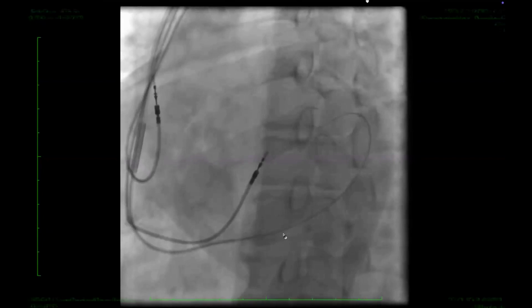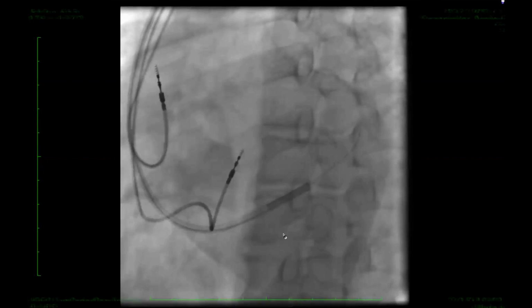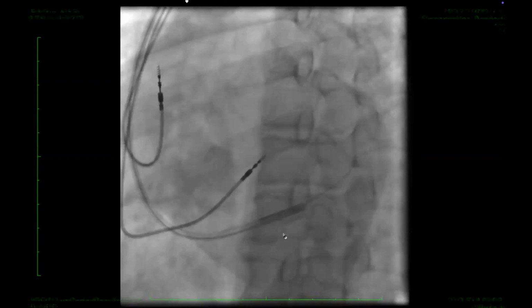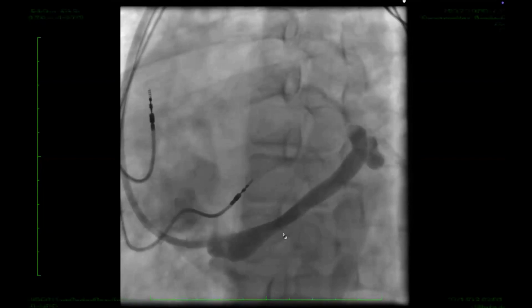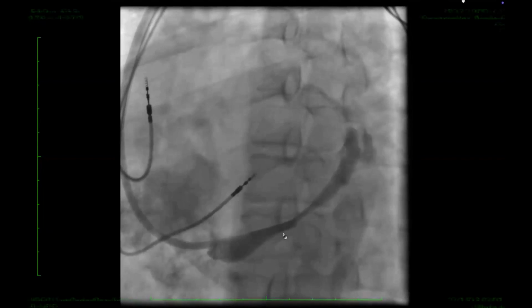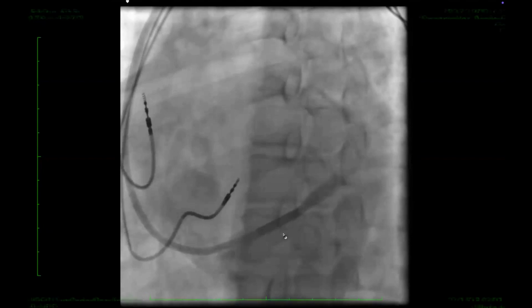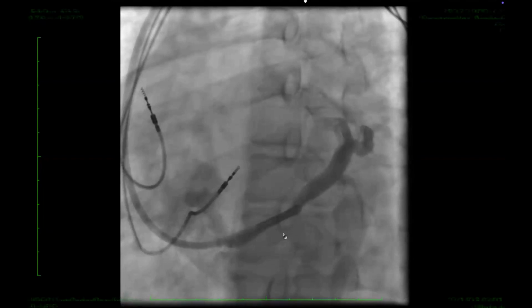So there's a guide wire in the coronary sinus in the LAO position, and over the Amplatz catheter, we've managed to deliver a coronary sinus guiding sheath. And this is a venogram that I obtained from that particular patient. So I've frozen it over there. You can see on the right-hand side, can you see my pointer at all or not? Yeah, you can see it. You can see the target veins.